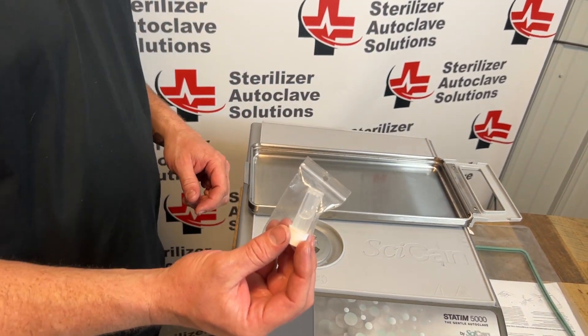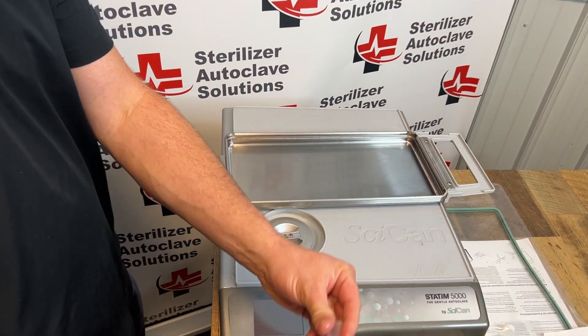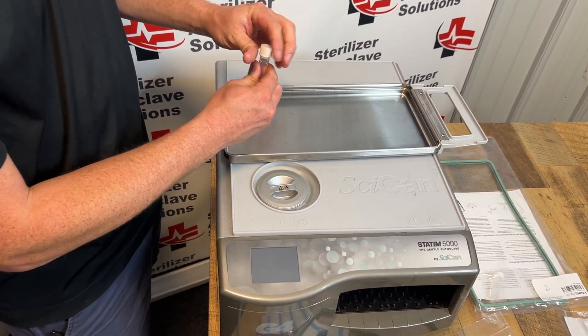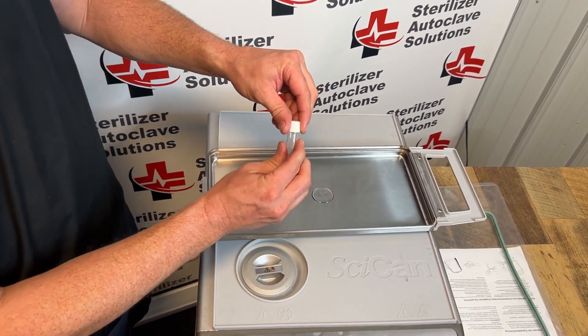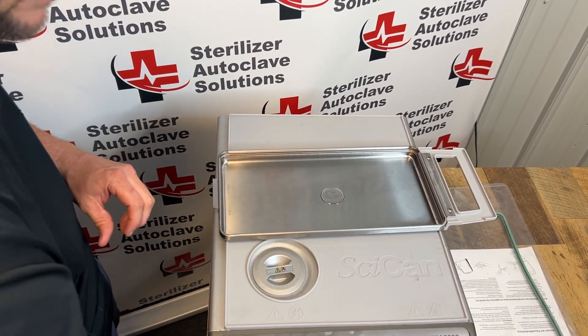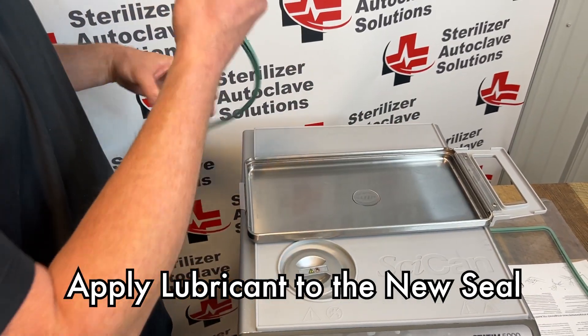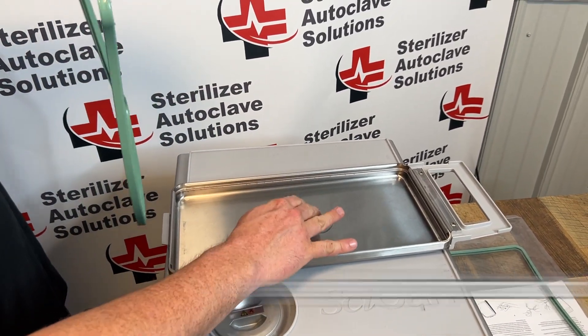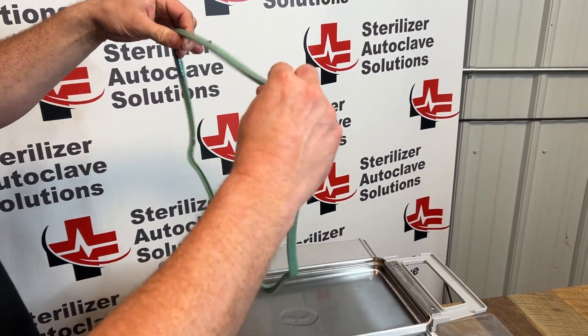Once we know that's good, I'm going to take some of the provided lubricant that comes with the new seal and pour about half this vial into the middle of this cassette. Next, I'm going to take the cassette seal, put a couple fingers in the lubricant, and just thoroughly lubricate this seal all the way around.